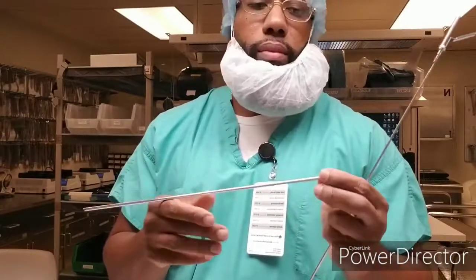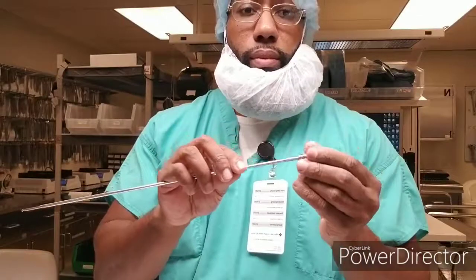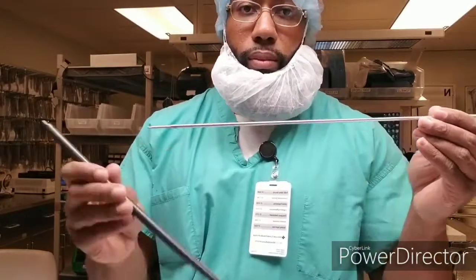Now there is another piece we want to try, and that is a larger version. Once again, one sleeve then the second sleeve — this one is also a five-millimeter. This one here is a stone forcep. Once again, one sleeve, second sleeve.